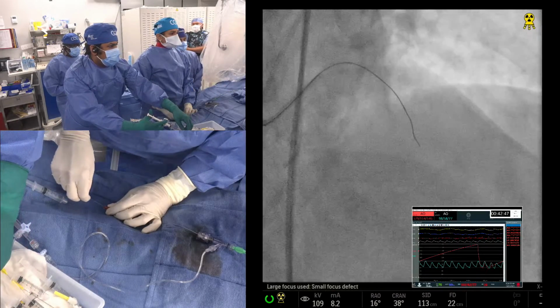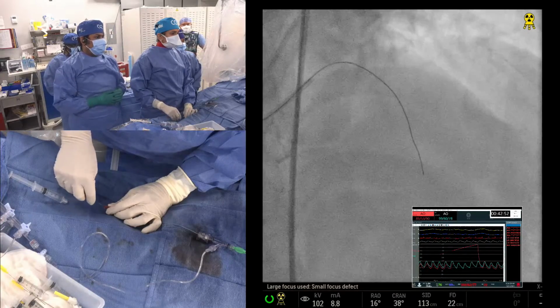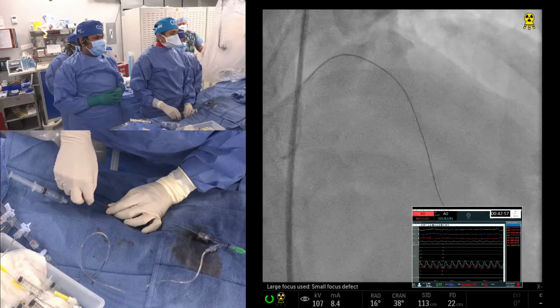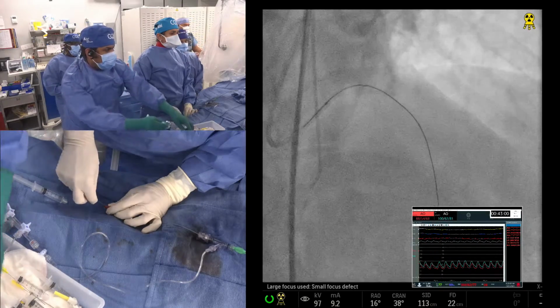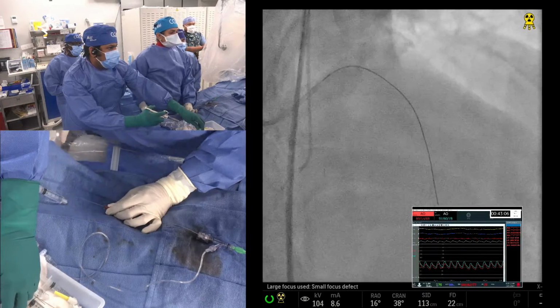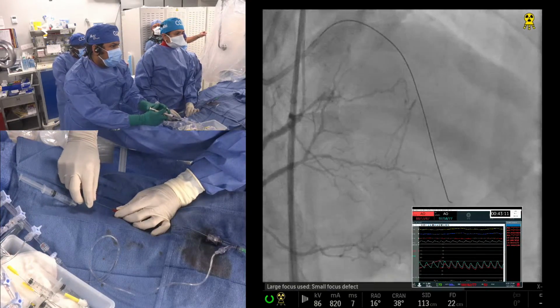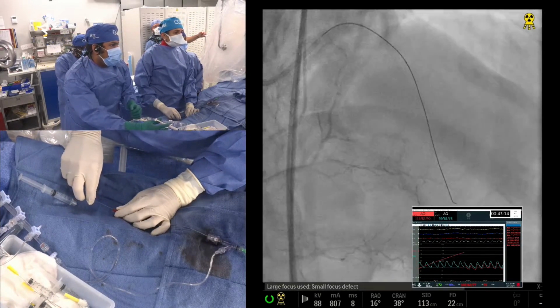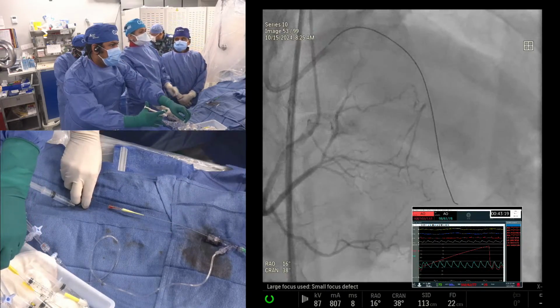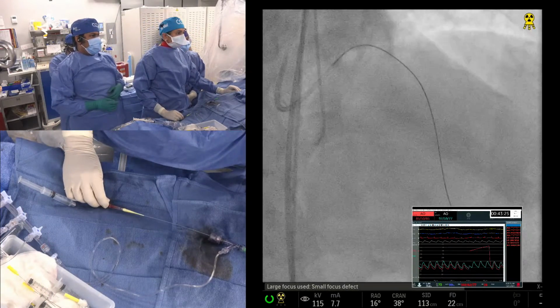No, it looks good. And remember, your own individual class 3 would be epicardials. Yeah, that's right. Okay, now you can take the injection and you'll be good. It's strange that with the wire making such good progress, the guiding catheter is still backing out. Yeah, they always will because it's a long segment. No, that was not the long segment. It was the other collateral, which this catheter is blocking now.